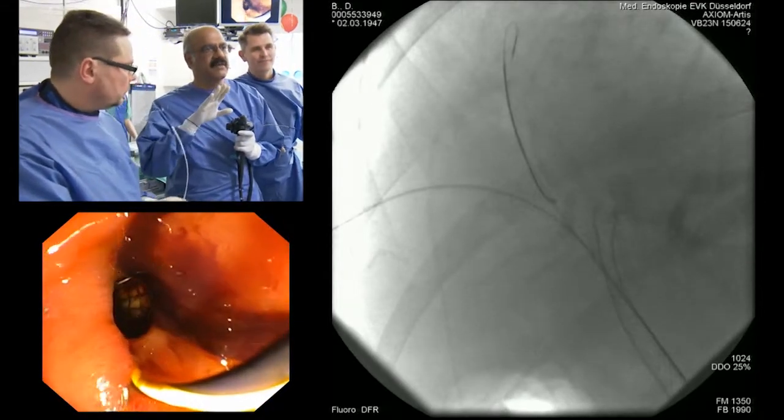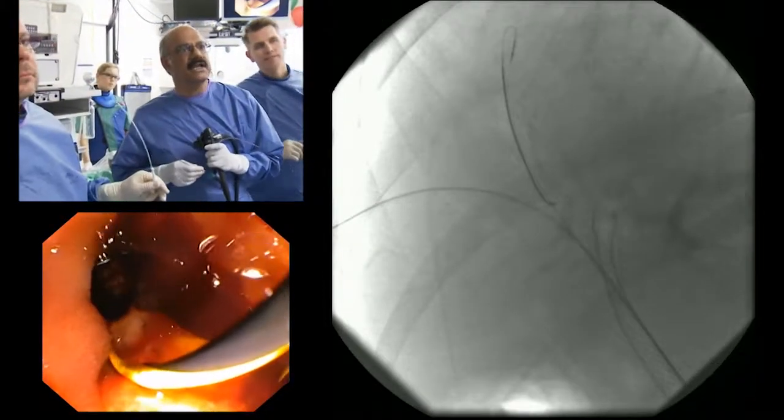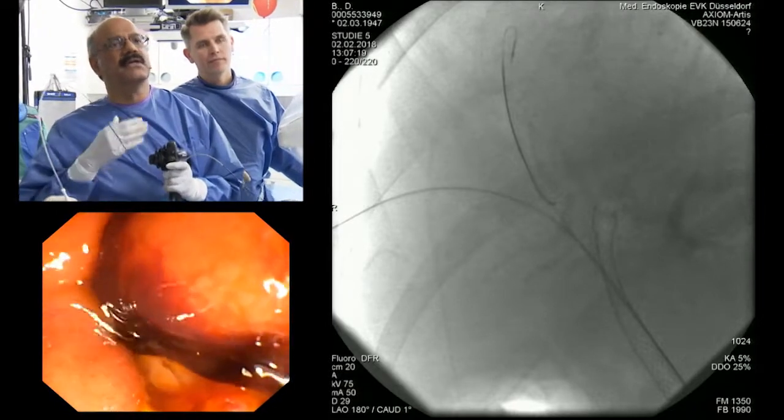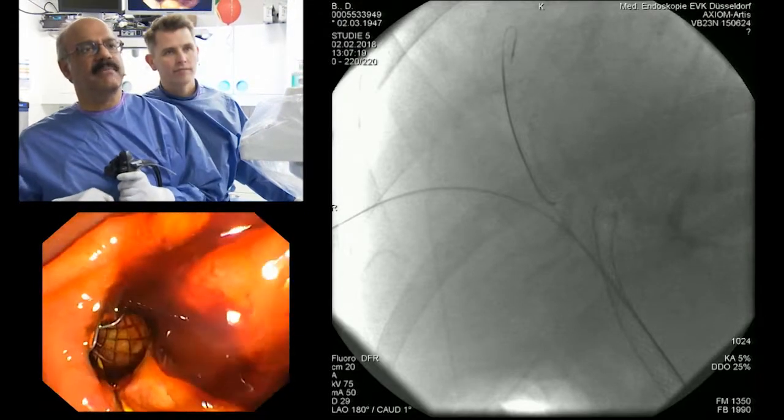We put in one stent on the left duct — you can see we have put in an Evolution stent. It is important, if you get an endoscopic picture, that the lower end is actually just outside the papilla. This is important because if you want to re-cannulate again when the stent gets blocked, you must always have it outside the papilla.